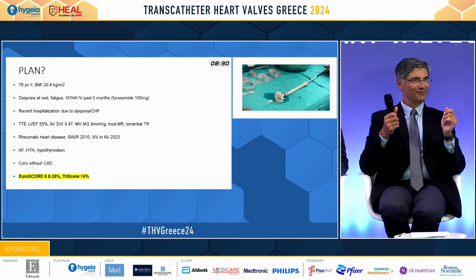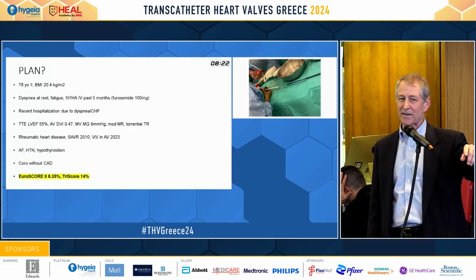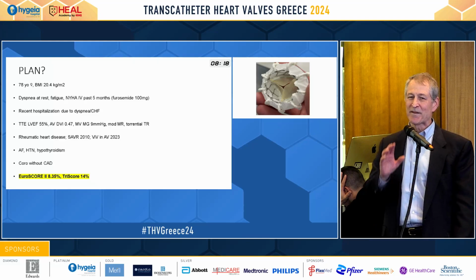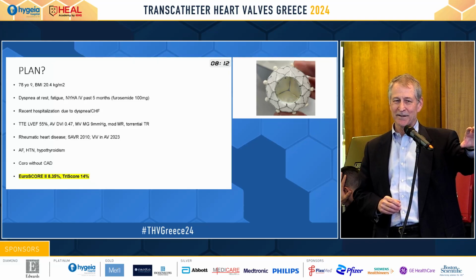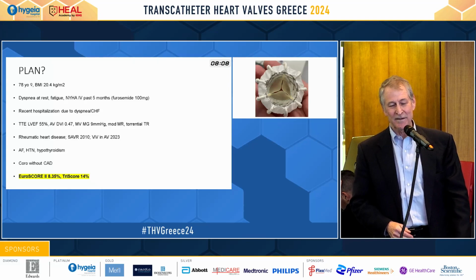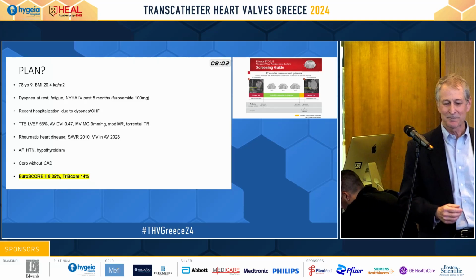Dr. Reardon's. Low risk for surgery, you need to fix that mitral valve at the same time, because that's not rheumatic. That's a right heart that's failing because of the left heart problems, and that mitral valve is causing more trouble than you think. You may think the gradient's 9 and there's moderate, but just look at that heart. That heart's sitting behind a really bad mitral valve, and that's what's caused the whole right heart to start to fail on you. So anytime you get the right heart look like that, they're all high risk. But if there's a low risk patient, you need to fix the mitral valve at the same time.